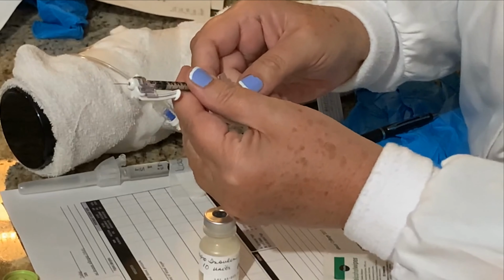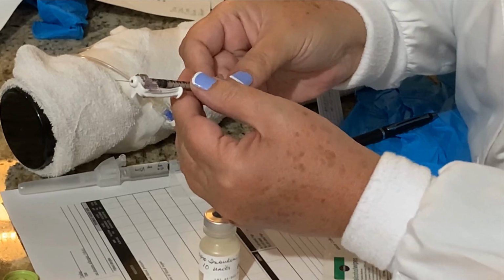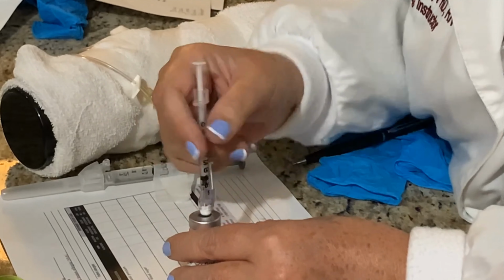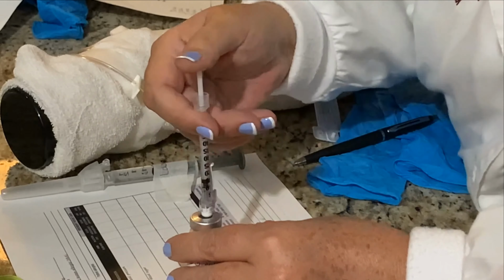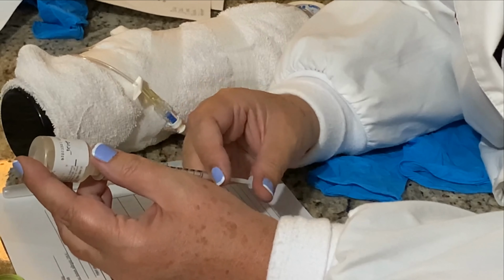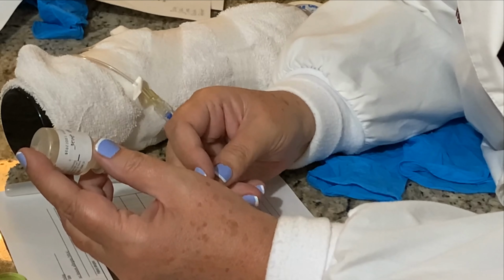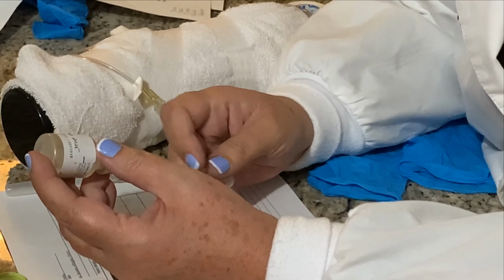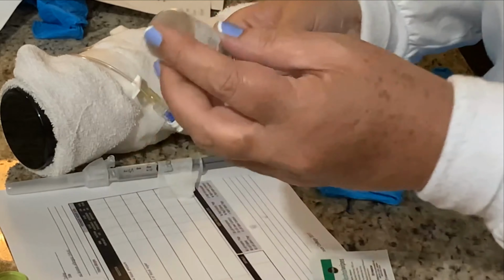And I'm going to give 10 units. My syringe is a 50 unit syringe, so I'm going to give 10 units. Put my syringe in, push my air in, pull back. Insulin really needs to be drawn slowly or you'll get a lot of air bubbles. So I can pull back to say 15 units, and then as you push up to 10, if that's what you're giving, you'll push the air bubbles out.